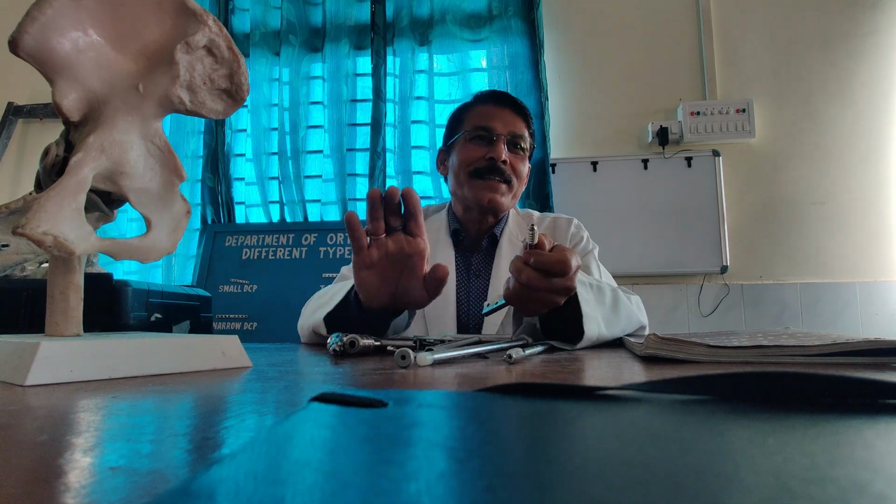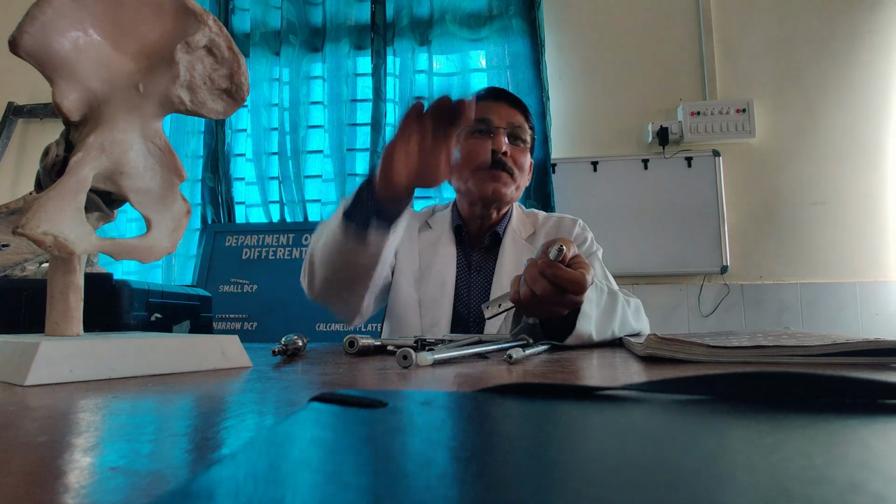Same principle. Here you must have integrity in the concave surface. You are applying the implant to the tensile surface, which is the surface where all the deforming forces are working, so we try to address that. That is why the plate should be placed on the tensile surface, to counteract the deforming force working over there. That is the basic principle. But this is going to help in those cases where you have good contact in the concave surface. If there is no contact, it is going to collapse, and cut-through is another problem that will come up. That is why the integrity of the posteromedial cortex is very important.